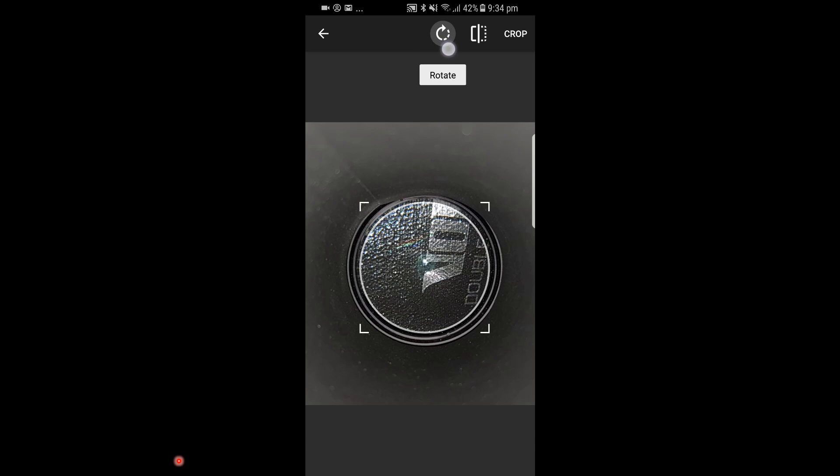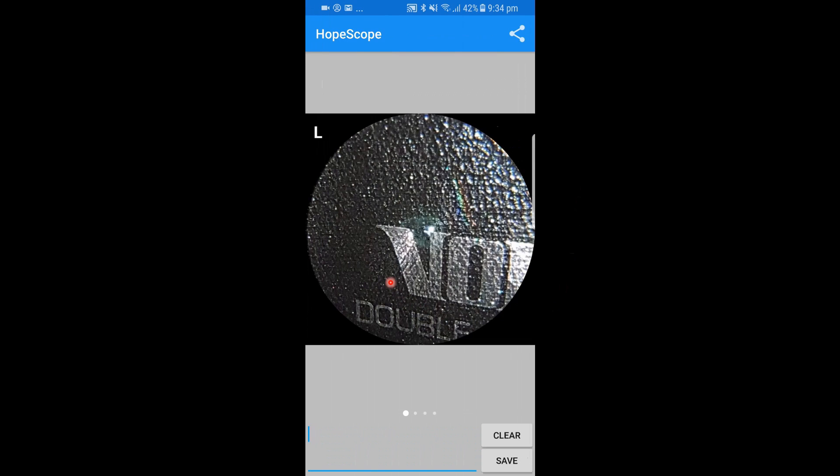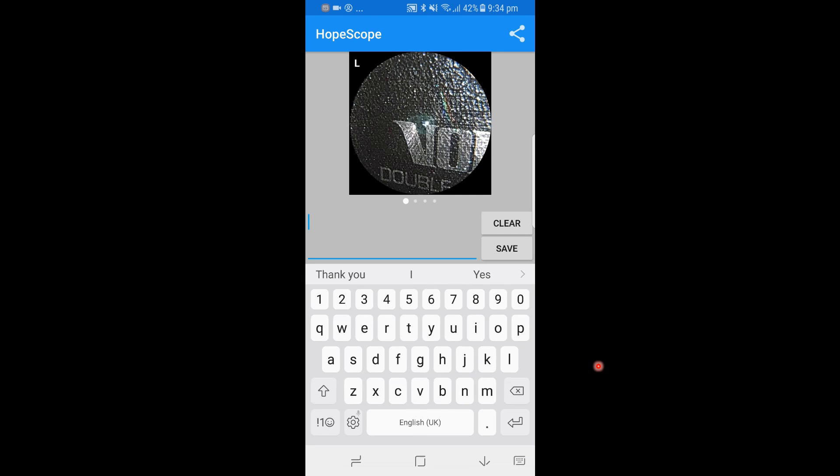One can also rotate the images to realign them, or flip the images both horizontally and vertically. There is also an option to add an image-specific diagnosis.